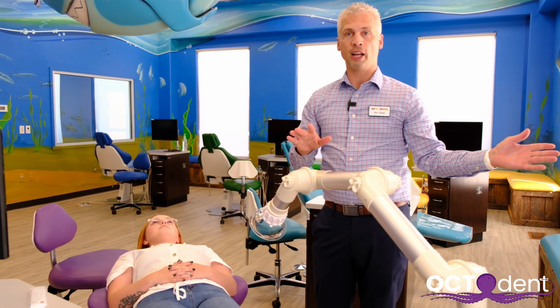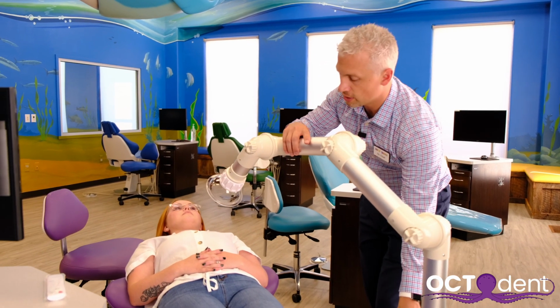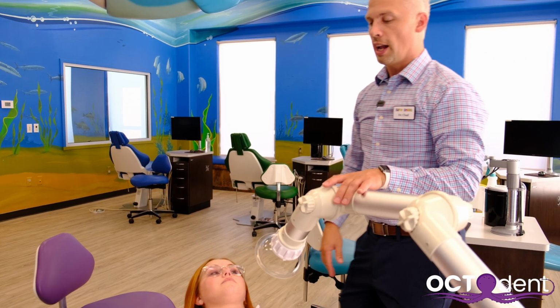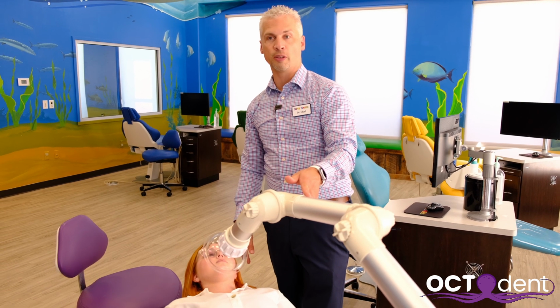So now I've got it moved out of the way. My patient can come in the room. My patient sits down, and then I merely let them know what this is, and we move this over top of their face so that they're not afraid of what it is. And if you notice, I'm going to swing this away. Okay? So then when I'm ready to use it, I just swing it back in front of the patient.